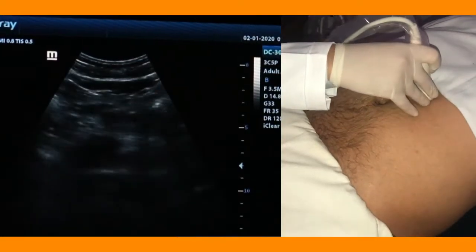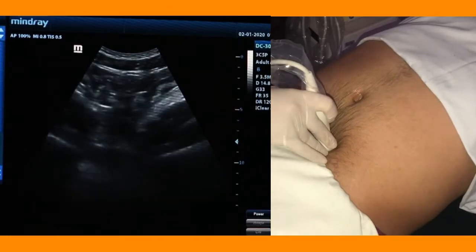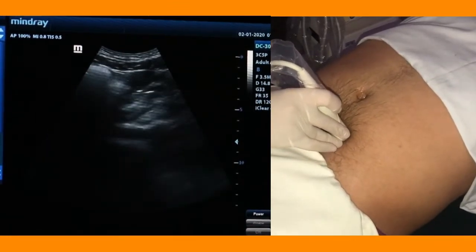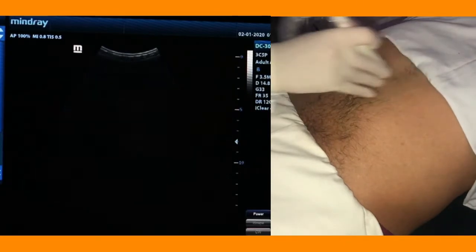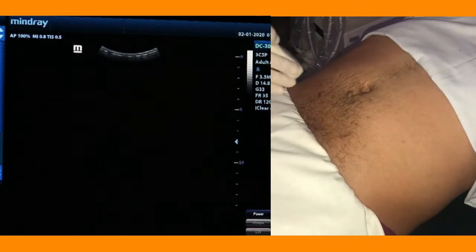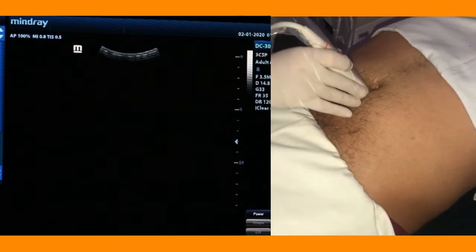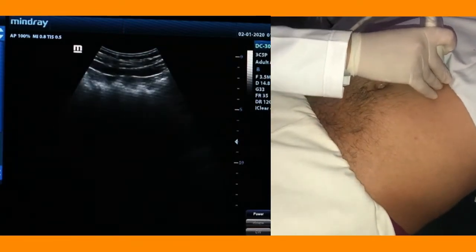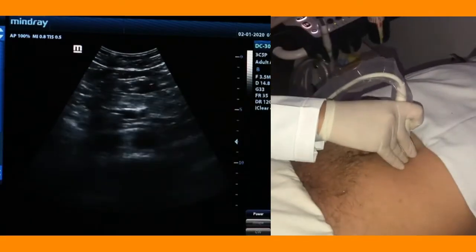Now we will start to examine the lower limb arterial system by examining the aorta. That means we should examine the aorta before going to examine the lower limb. So, how do we examine the abdominal aorta by Doppler? Start by transverse perpendicular in the midline, going directly here.